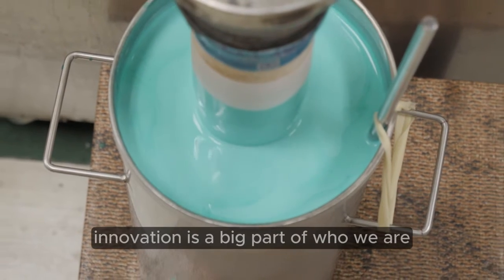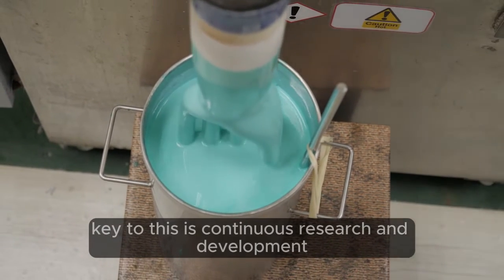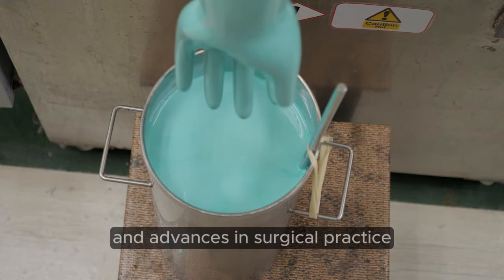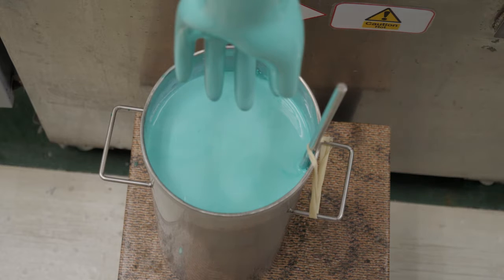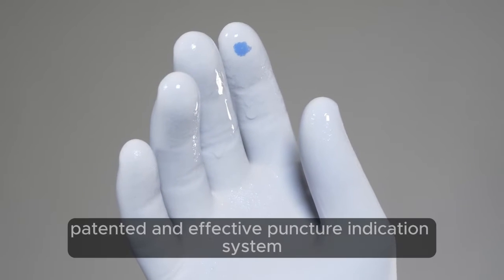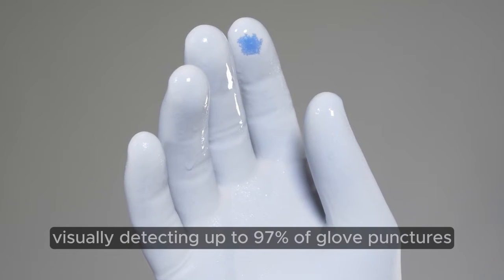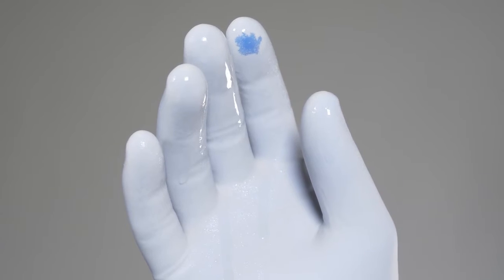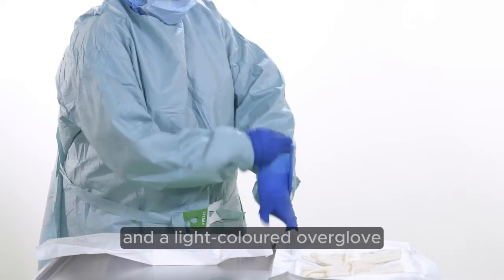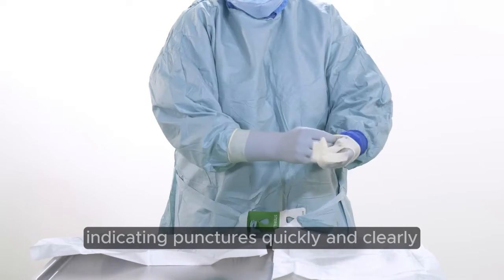Innovation is a big part of who we are. Key to this is continuous research and development, because we know it's important to stay aligned to customer needs and advances in surgical practice. One such example for Biogel is the world's first patented and effective puncture indication system, visually detecting up to 97% of glove punctures. This system features a dark coloured under glove and a light coloured over glove to provide the optimum level of contrast, indicating punctures quickly and clearly.